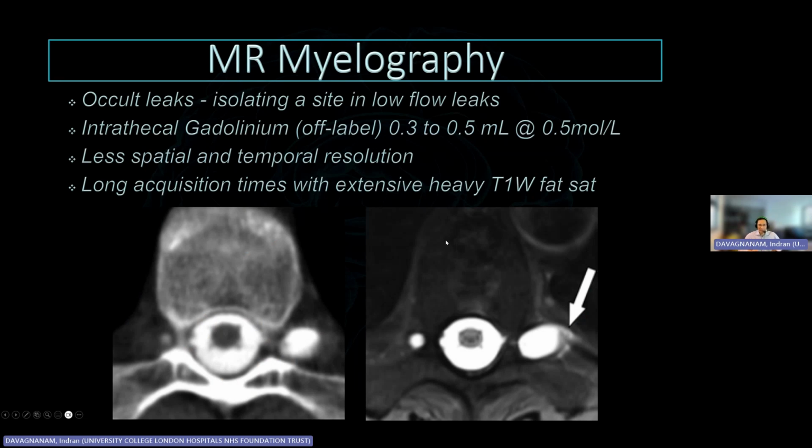We don't use a lot of MR myelography, and there are two particular reasons why that's the case. It can be very useful, and you can see some utility to doing so. However, it does involve the off-label introduction of gadolinium into the intrathecal compartment. It's well recognized that even at low doses, intrathecal gadolinium or any form of contrast agent can provoke seizures. But gadolinium appears to have a lower threshold to provoke seizures. So we try and avoid that, certainly in our institution.